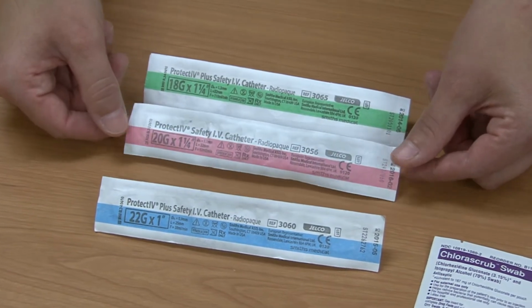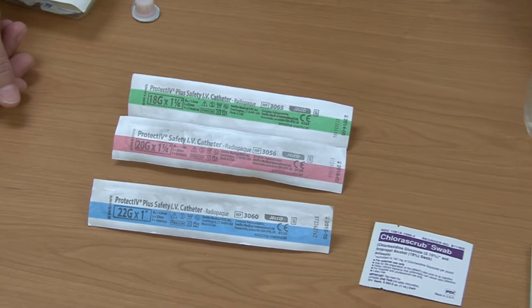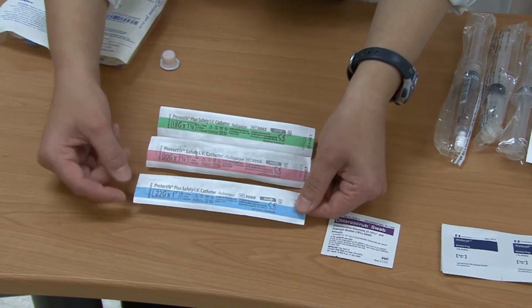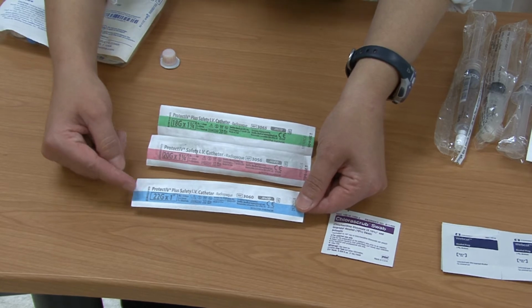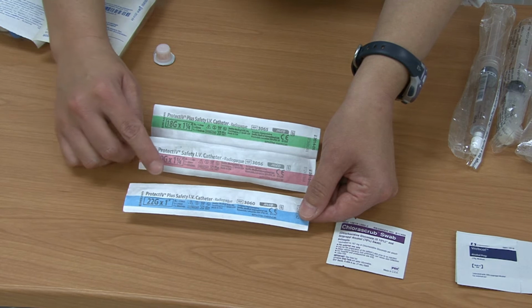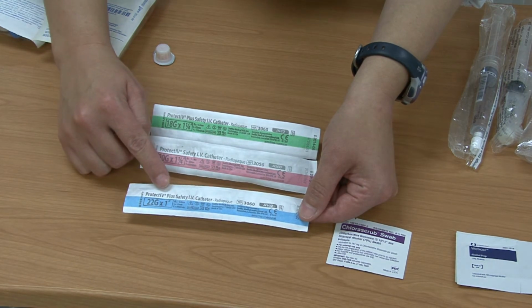So whenever you're assessing your patient's veins, you want to make sure that they are wide enough in diameter to accommodate the diameter of the catheter. You also want to make sure that you have a length that is long enough for the vein that you're going to put it in that would accommodate the length of the catheter.